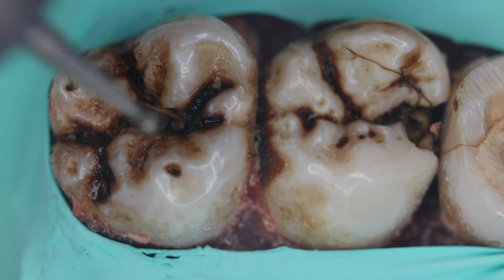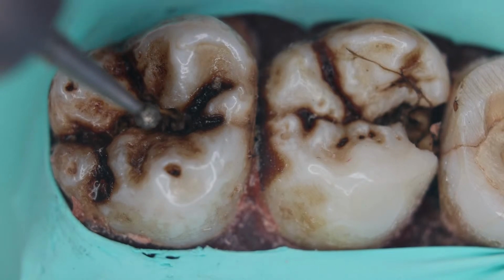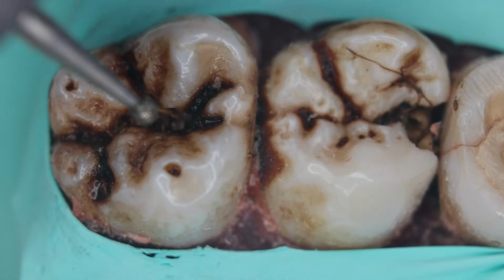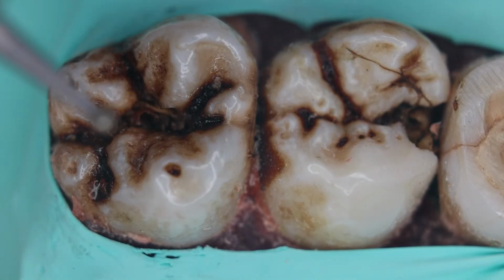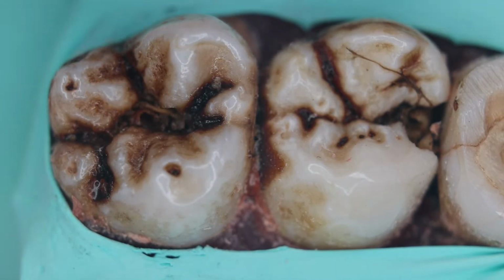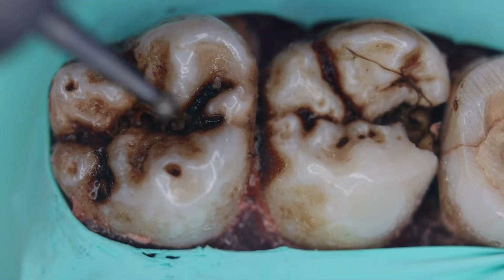So initially what we are using is this small round burr. There are two types of round burr. One is the big ball and this one is the small. So this has a minimal depth, or the maximum depth of, you can say, 1 millimeter. So basically we are just creating the initial punch cuts with this. So we are into the enamel with this round burr. So let us begin the steps.